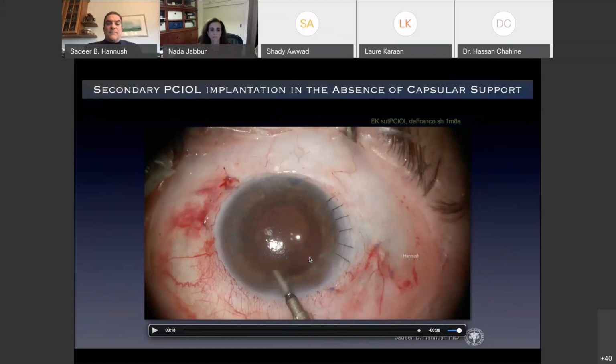The importance of this, you may be aware that many people in the 90s and 2000s criticized these techniques by arguing that polypropylene suture eventually breaks or lyses. Now, cardiovascular surgeons will tell you that polypropylene doesn't really break unless it's under stress. So what happens with polypropylene is that it chafes on the edge of the haptic or through the eyelet.